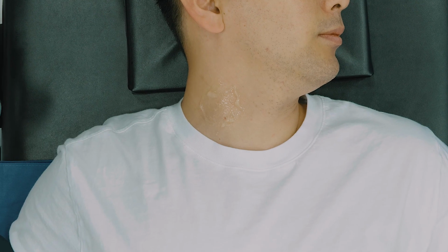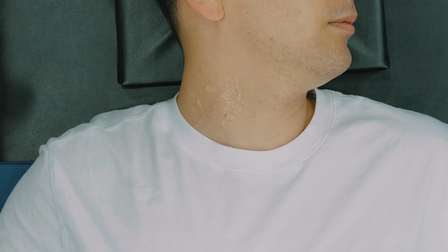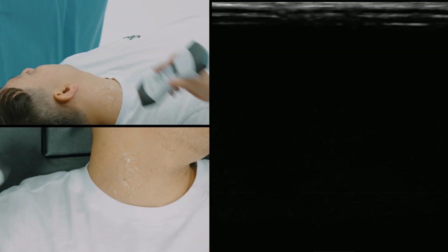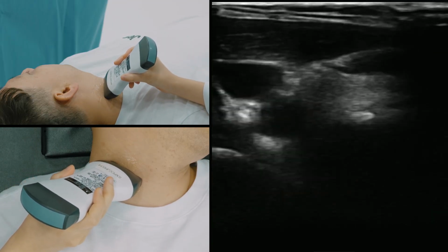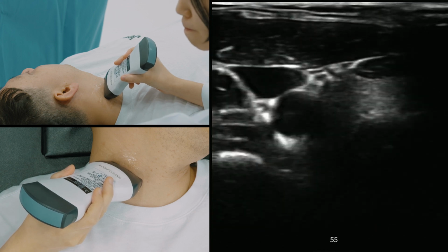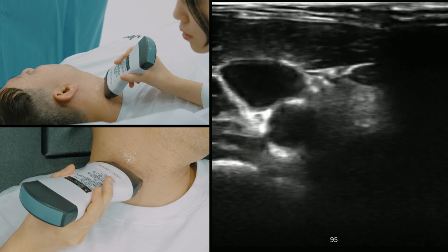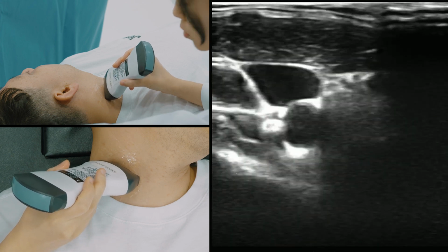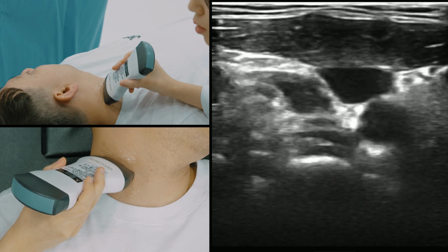For ultrasound-guided central venous catheter placement, start by using ultrasound to identify the anatomy: veins, arteries, and nearby structures. This step is best performed before prepping. Utilize both short-axis and long-axis views to pinpoint the vein's location relative to the artery. Look out for issues like hypoplastic veins or underfilling due to hypovolemia.